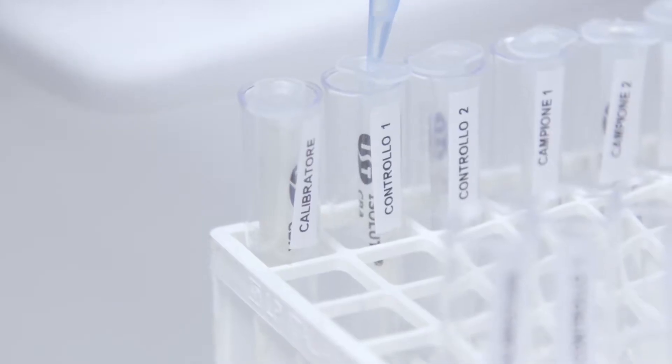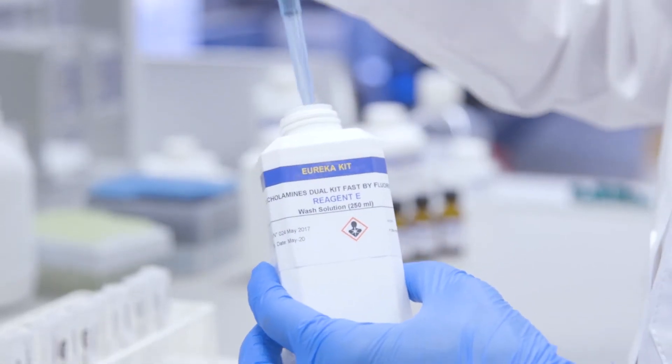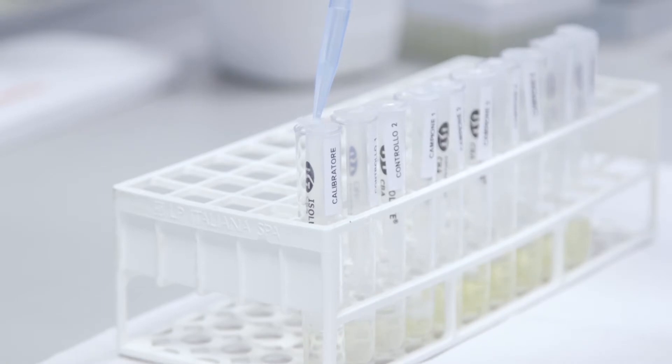Let it slowly percolate at a flow of approximately 1 milliliter per minute. At this point, we wash the column by adding 1 milliliter of reagent E washing solution and repeat this operation twice.